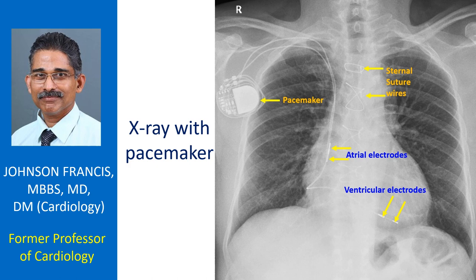Here is an X-ray of a person with a pacemaker. The pacemaker pulse generator is seen in the right infraclavicular region.